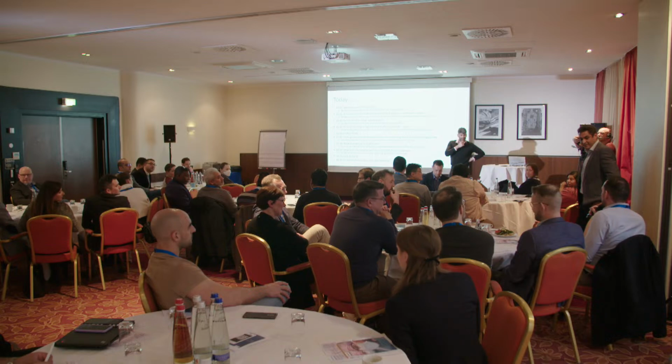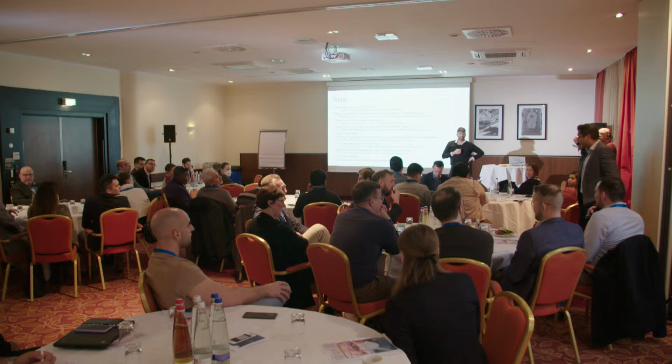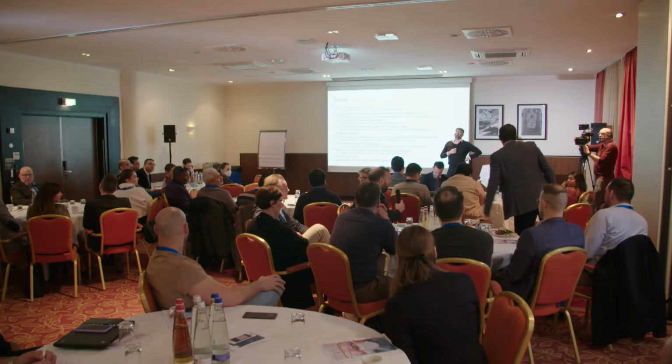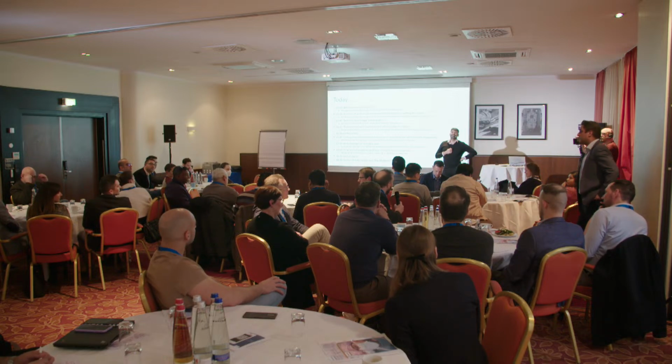Hi, I'm Nikos Konstantinou. I'm here from the LMU in Munich. We've mostly used it for aortic dissection, complex aortic dissection cases. BTK, I find it very useful, and I'm here to get convinced to start using it in the SFA. I'm Mike Robinson. I work at GSTT, so I'm developing my practice with IVUS under the mentorship of three of the speakers today.